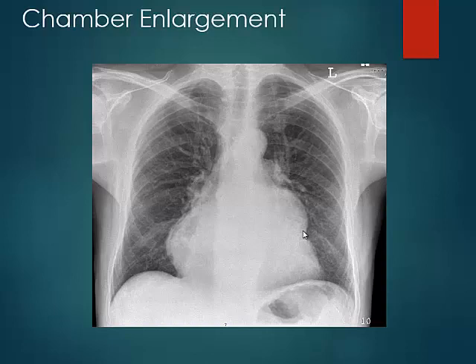Mitral stenosis. From which cause? Rheumatic. So it's specific to rheumatic valve disease of the mitral valve that we see enlargement of the left atrial appendage. Otherwise, as rheumatic valve disease is less common in the Western world, we don't see left atrial appendage enlargement like this. So this patient had mitral valve stenosis from rheumatic disease, with enlargement of the left atrial appendage, subsequent pulmonary venous and pulmonary arterial hypertension, and also right atrial dilatation.